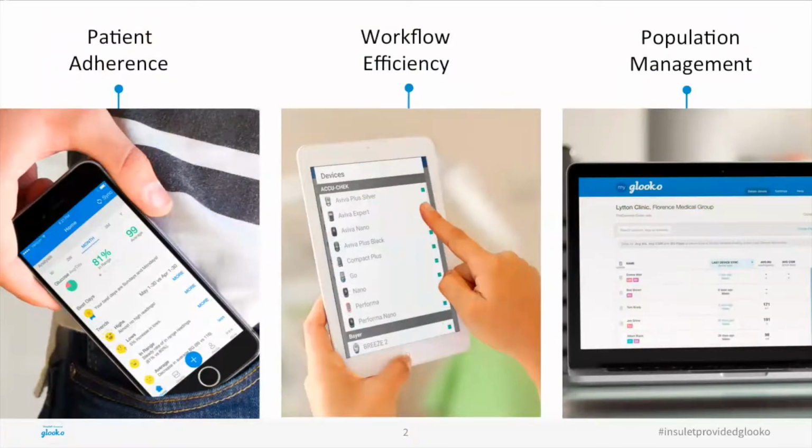With Insulet-provided Glooko, there are three core benefits that enable diabetes management success at your clinic. The first is facilitating patient adherence to the treatment plan, followed by workflow efficiency, and lastly, patient population management. Let's take a look at each of these in more detail.